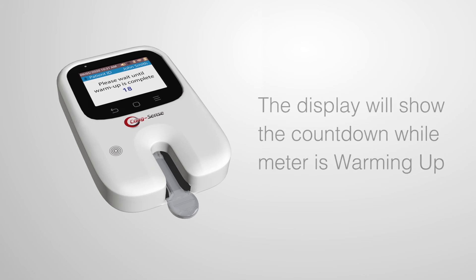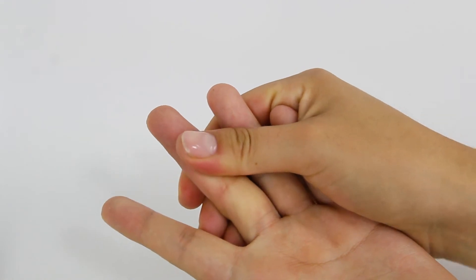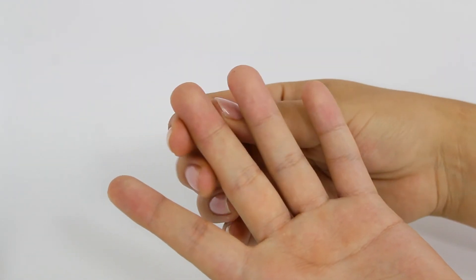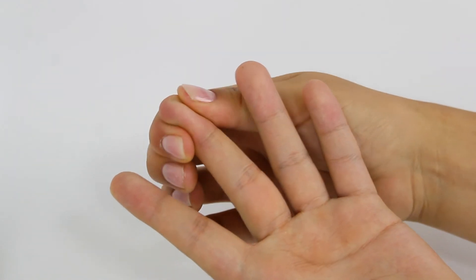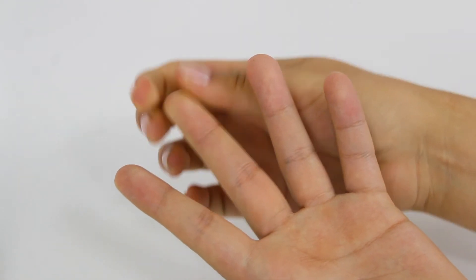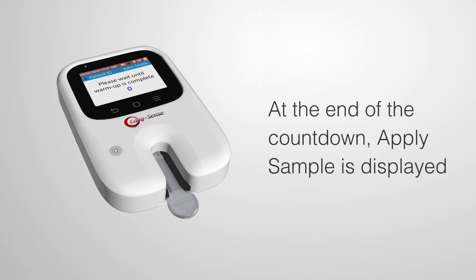During this time, hold your hand below your heart and massage the middle or ring finger from the palm of your hand toward the last joint of the finger. At the end of the countdown, apply sample is displayed.